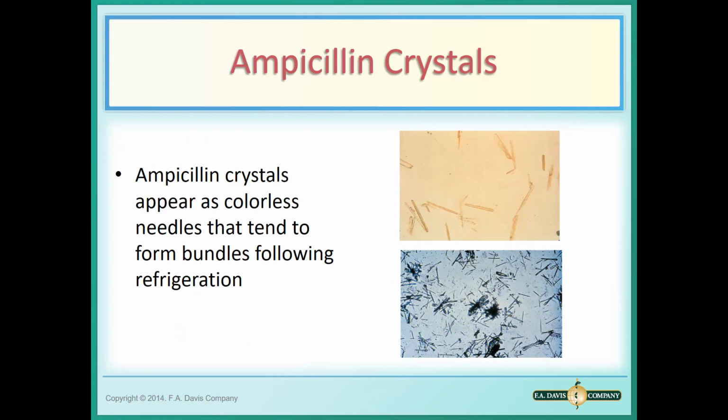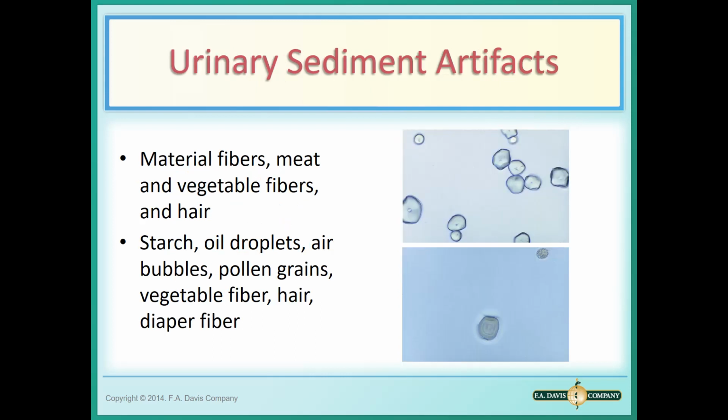Ampicillin is another crystal that is needly and bundly. So there's a few things that can cause needles and bundles, and we tend to know what someone is on when they get this.